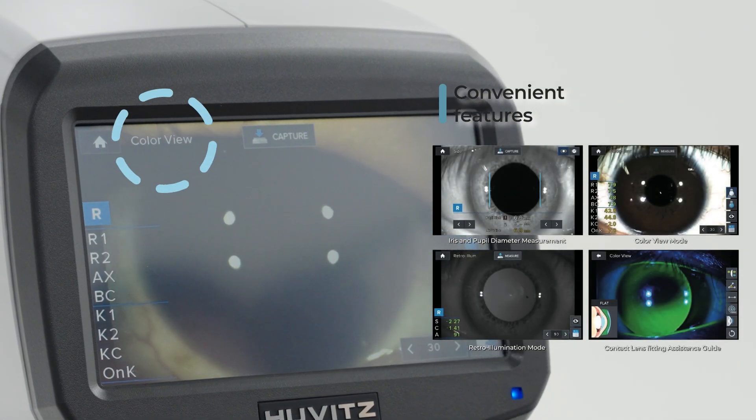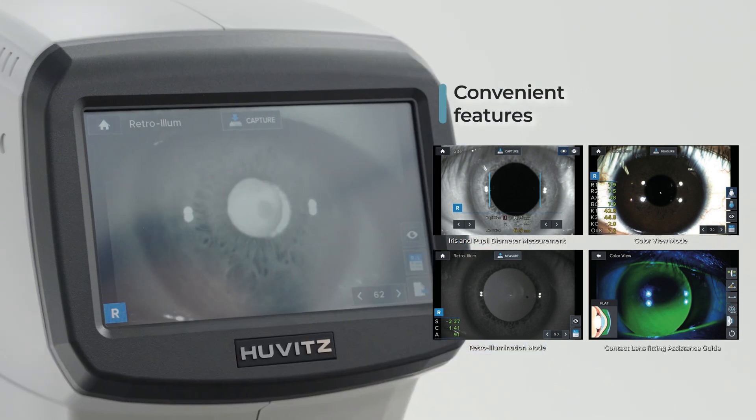You can easily use various features, such as Color View mode and Retro Illumination mode.